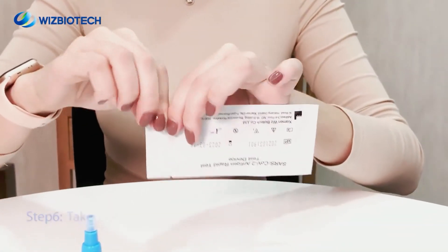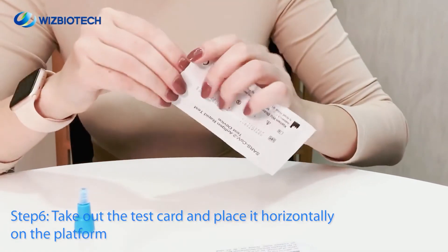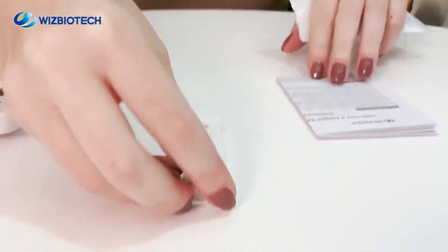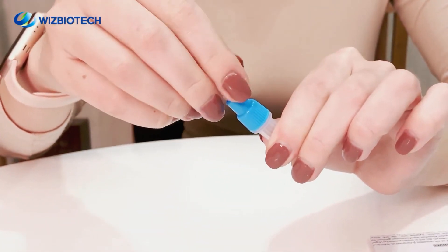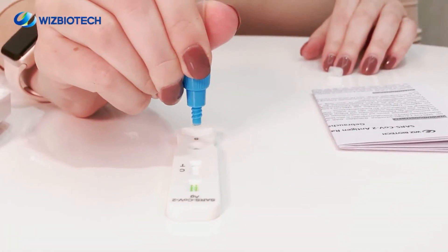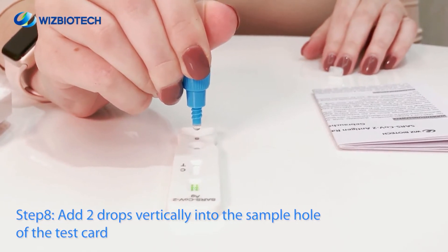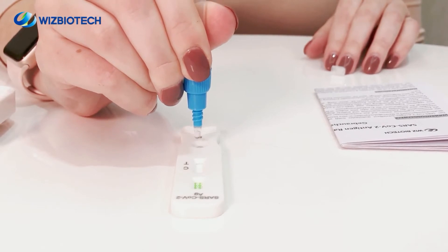Step 6. Take out the test card and place it horizontally on the platform. The platform should be in a horizontal and stable state and it is strictly forbidden to tilt or shake. Step 7. Unscrew the sample extraction tube. Step 8. Invert the sample extraction tube vertically and drop two drops of the sample extraction mixture vertically into the sample hole of the test card.